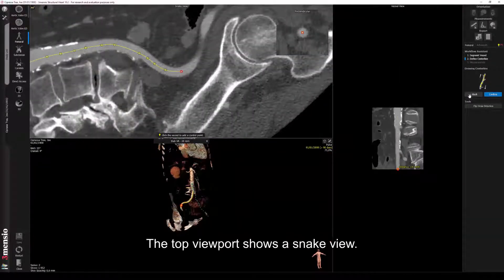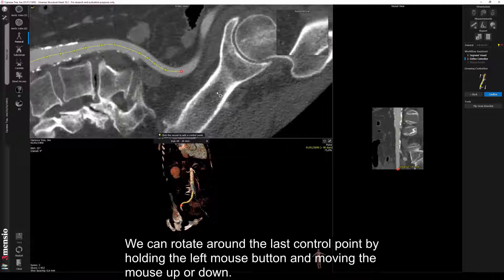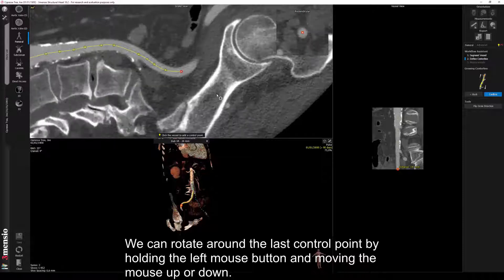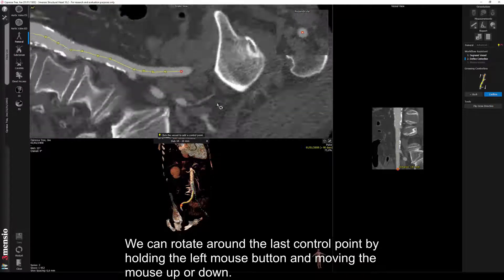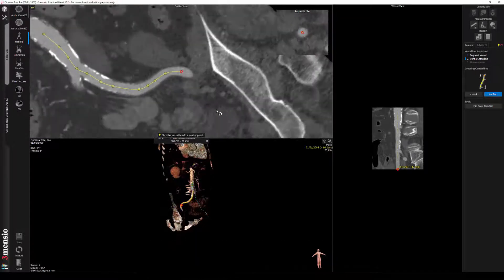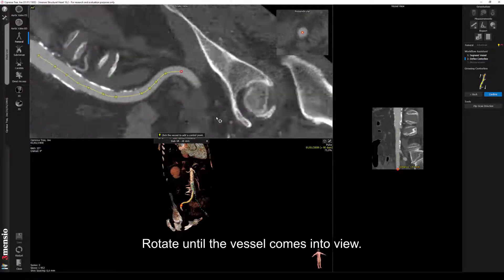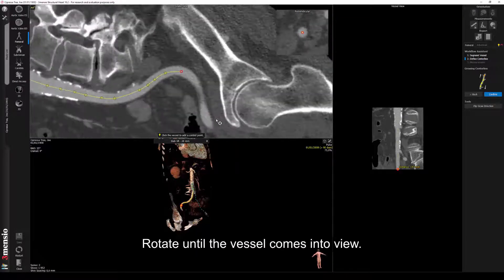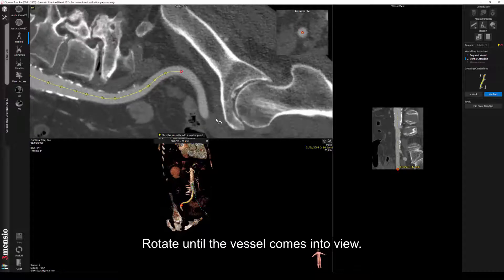The top viewport shows a snake view. We can rotate around the last control point by holding the left mouse button and moving the mouse up or down. Rotate until the vessel comes into view.